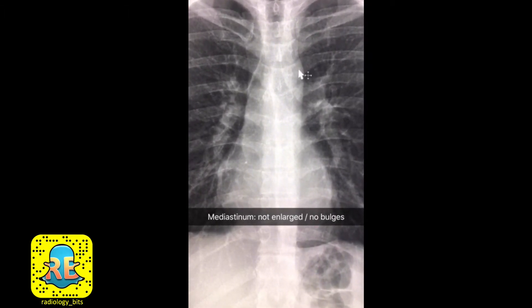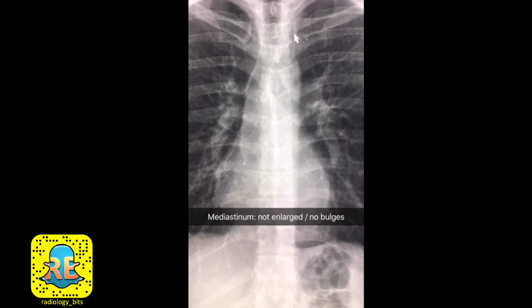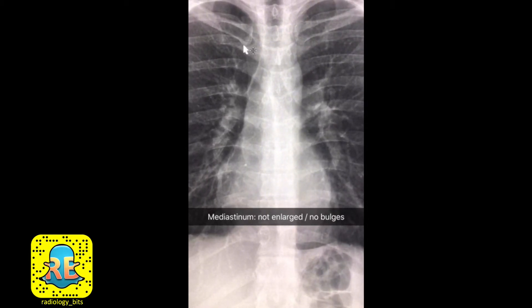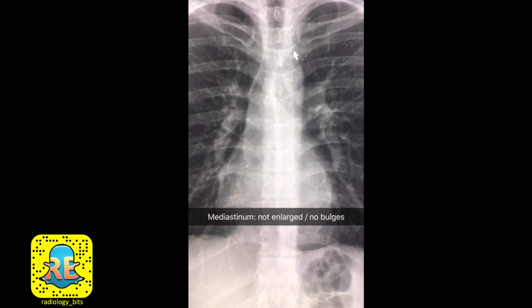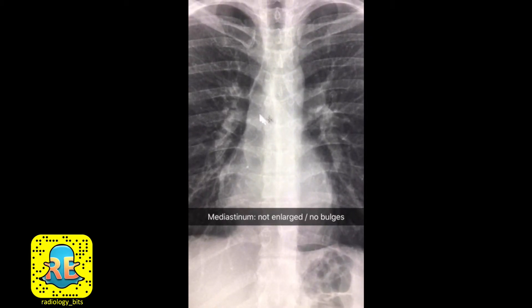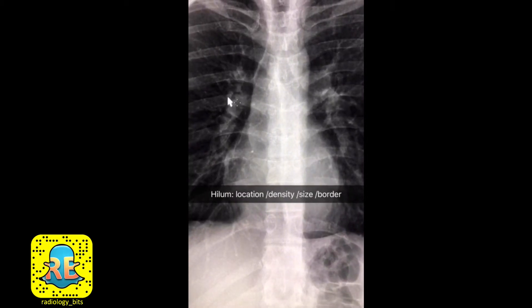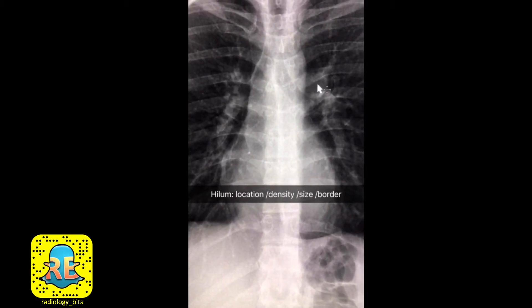The first point is to look at the mediastinum. The mediastinum should not be enlarged and the borders should not be convex outwards. As you see here, the borders are relatively straight, there are no convexities, and the mediastinum is not enlarged. The second area to look at is the hilum.